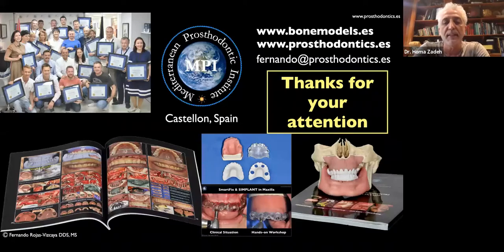It was really fantastic. This is obviously a very, very complex area. If there are any questions, I'm happy to pose them to Fernando. But let's start with the first question, regarding the case that you did where you did the immediate loading, where you had to reduce some bone and basically replace just the white aesthetic, just replacing the teeth without any prosthetic tissue. Can you give any guidelines in terms of when you do this kind of restoration, what would you consider the longevity of an all-zirconia, monolithic zirconia restoration if you're just replacing the teeth without any kind of pink ceramic component? Is there any potential for fracture?